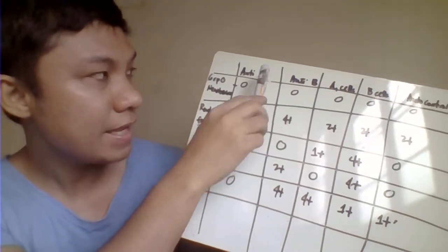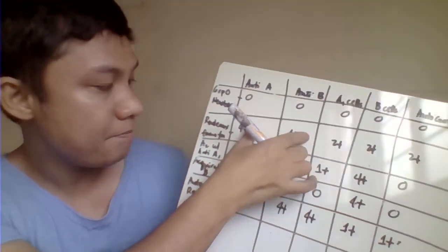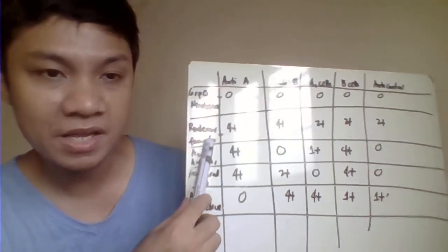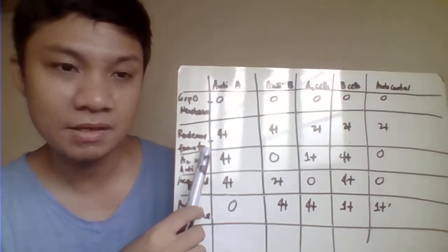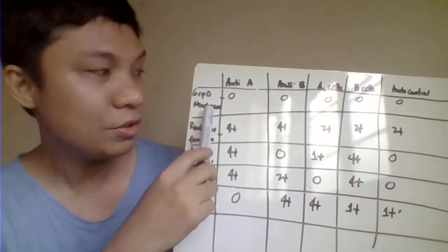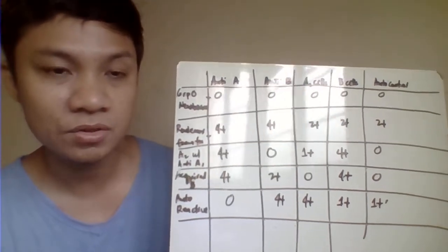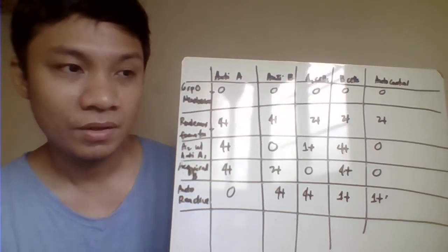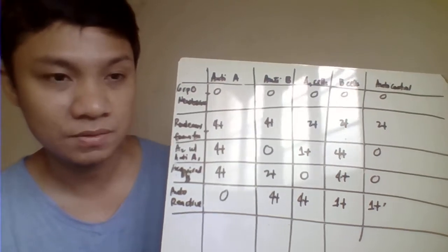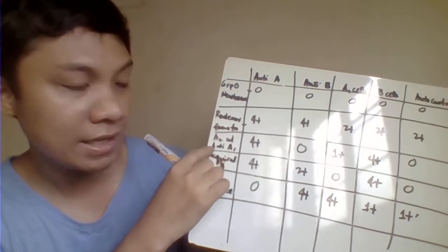Another one, we have your anti-A1, anti-A, so this is again your forward typing. Okay, so lahat ay positive, that will signify rouleau formation. So again, pag rouleau formation, ang ating resolution ay saline washing para ma-disperse ang rouleau formation. Ito naman, you could enhance agglutination reaction if there is a problem with antibody production by incubating at room temperature for 15 to 30 minutes, or at 4 degrees Celsius for 15 minutes to enhance your antibody production.